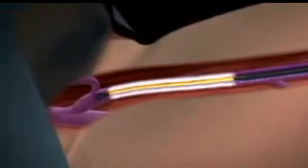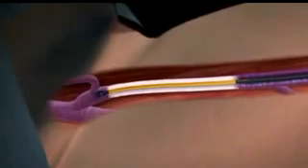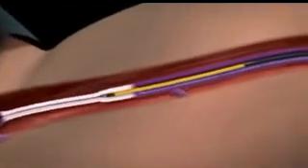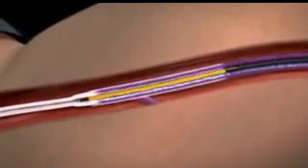Now Venus introduces the Closure Fast Radio Frequency Catheter, a next generation technology that uses a new segmental ablation technique instead of the old continuous pullback approach.